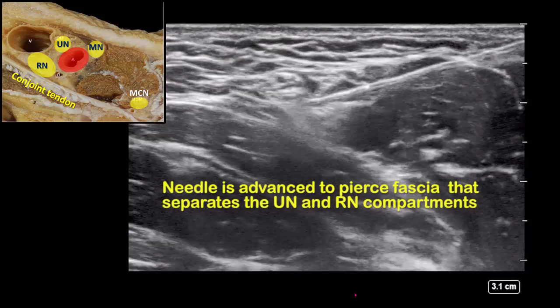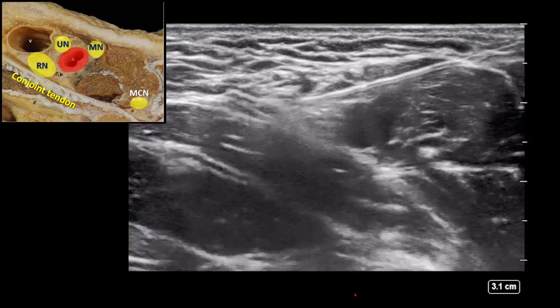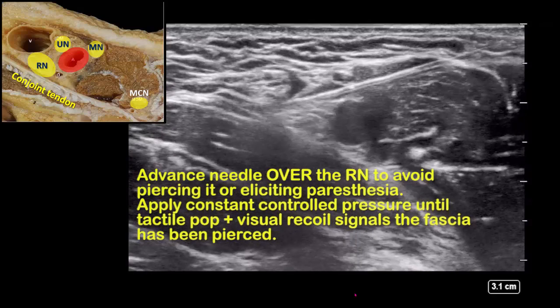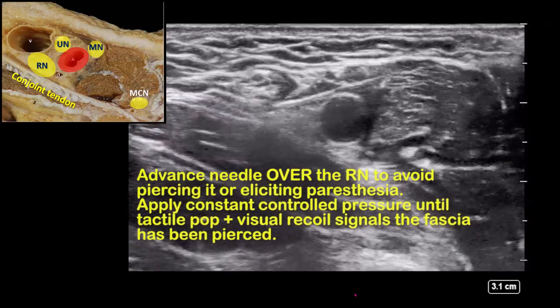Press forward with constant controlled pressure until you feel a tactile fascial pop and see a visual recoil of fascia, signaling that the fascia has been pierced.